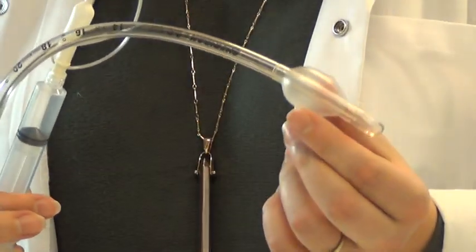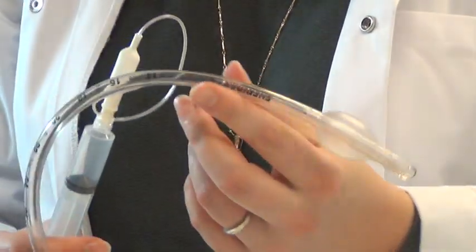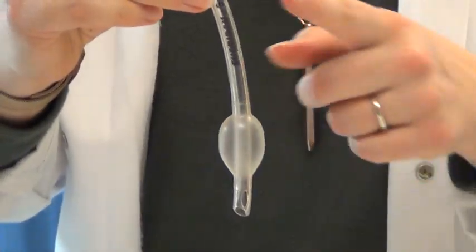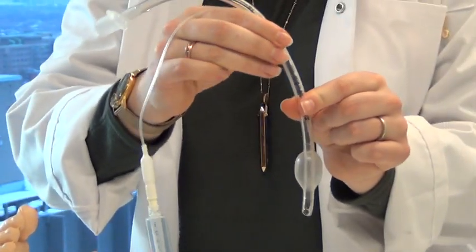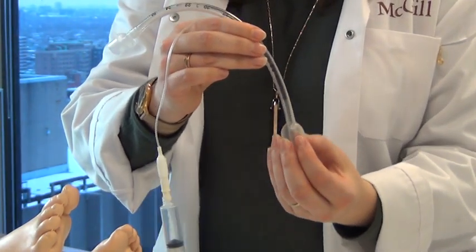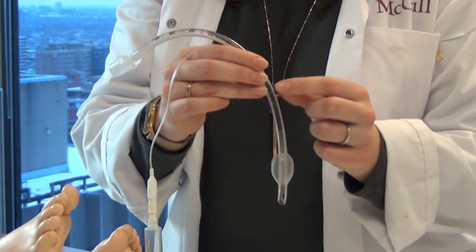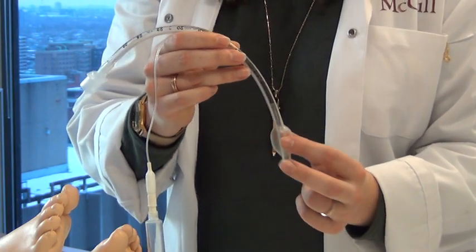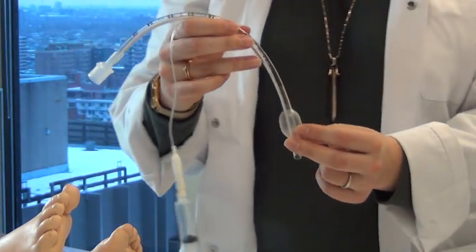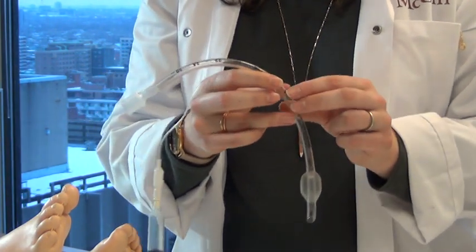There is a way for us to assess if these balloons are overly inflated or underinflated. If they're underinflated, you will actually hear gurgling come out, because as this is inserted in the airway, this tube passes through the vocal cords that are around here. And if the balloon is slightly deflated and there's air that's passing through the vocal cords, it will make a sound. If it's overly inflated, the risk is actually causing necrosis in the airway, and that can cause obviously additional issues. So we wouldn't want any necrosis, so we do not want this balloon to be overinflated.